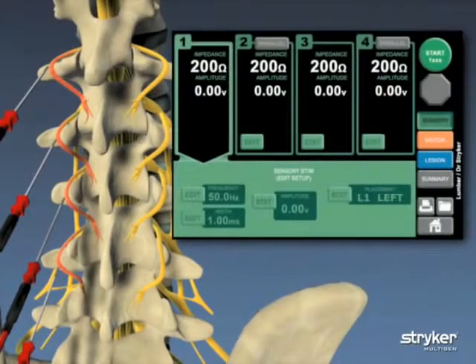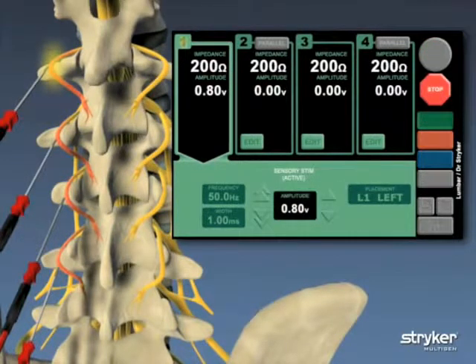On the Multigen touchscreen, the sensory phase of the procedure is active and the user has the option to modify default or saved settings to more customized procedural settings. When setting adjustments are complete, the sensory stimulation tests are administered individually at each needle site.